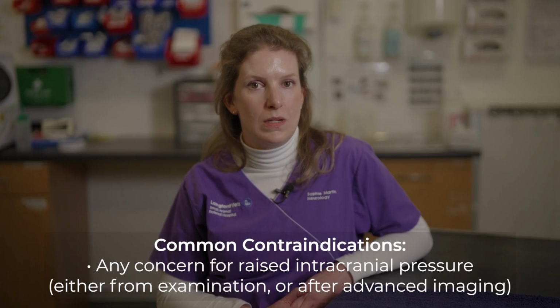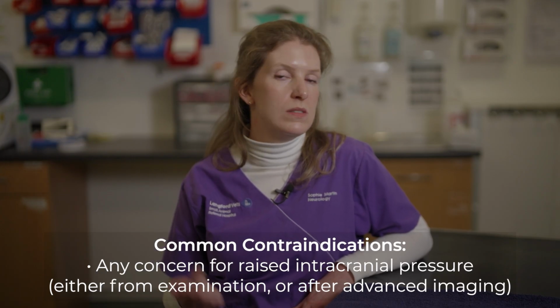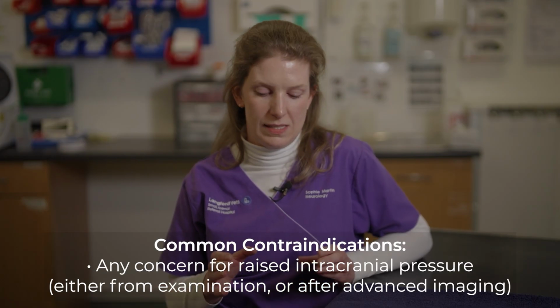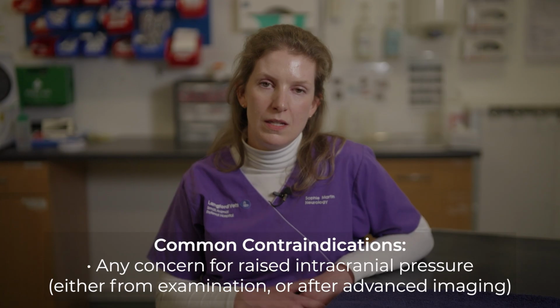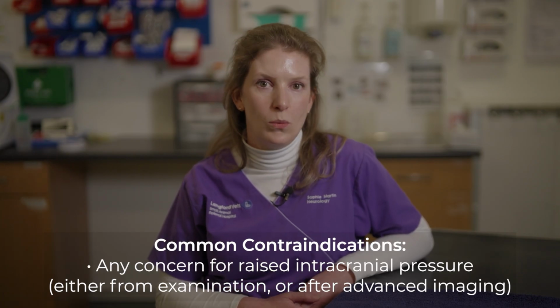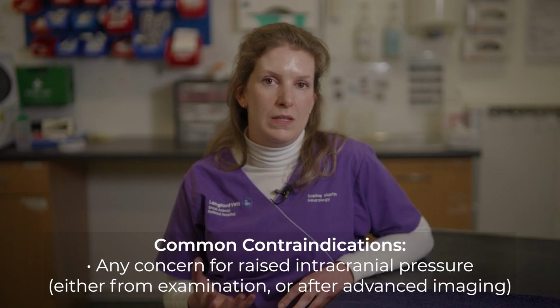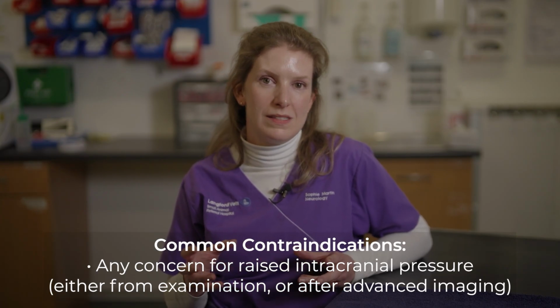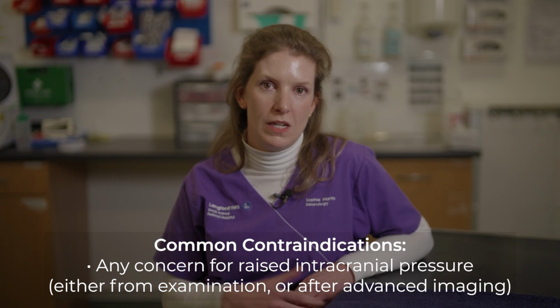So when you're taking cerebrospinal fluid, most commonly you take it from the cisterna magna, so behind the brain, or the lumbar cistern at the base of the spine. And you need to have a cavity with that fluid to be able to sample with your needle. So if you have any raised intracranial pressure, whether that be secondary to inflammation or a tumour, what can happen is the brain might herniate, and that means that that spinal fluid space has gone. It's now filled with brain tissue, and it means you can cause harm when you take your spinal fluid.